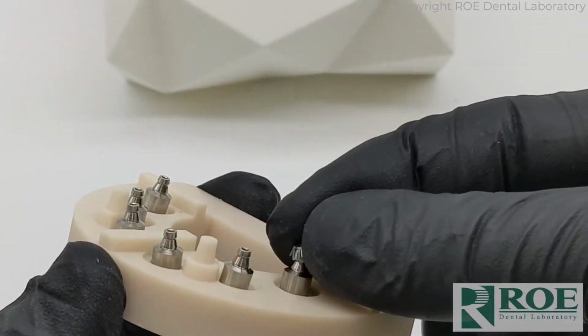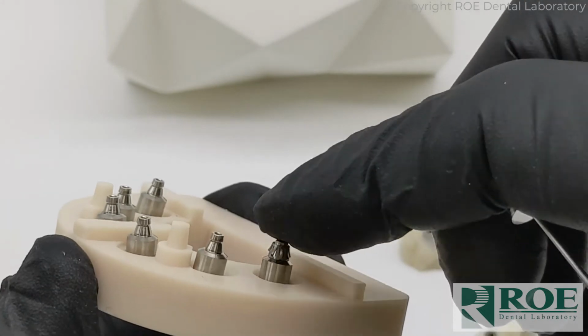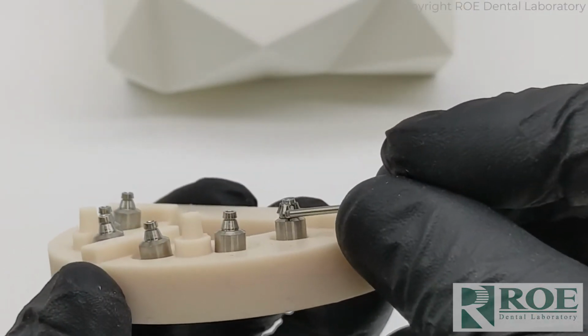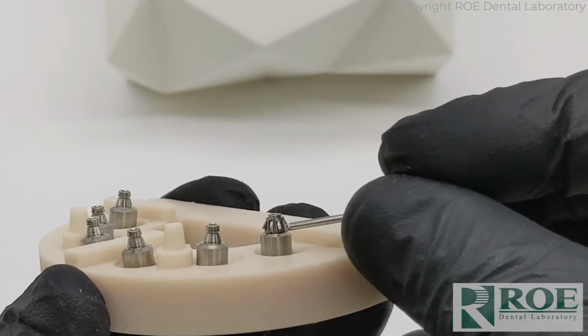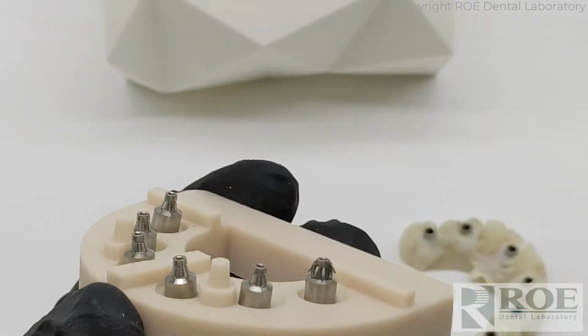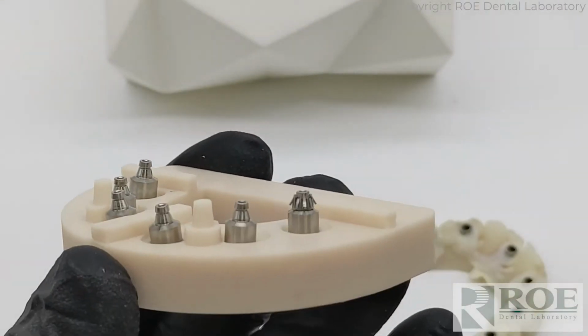We have to put it on a little bit further until it spins. There. See a little bit of a spin, just like that. So I'm going to put all these on, and then we'll do the pickup.